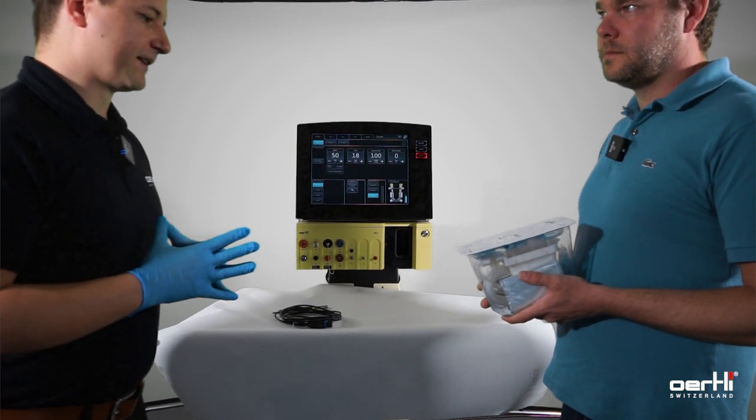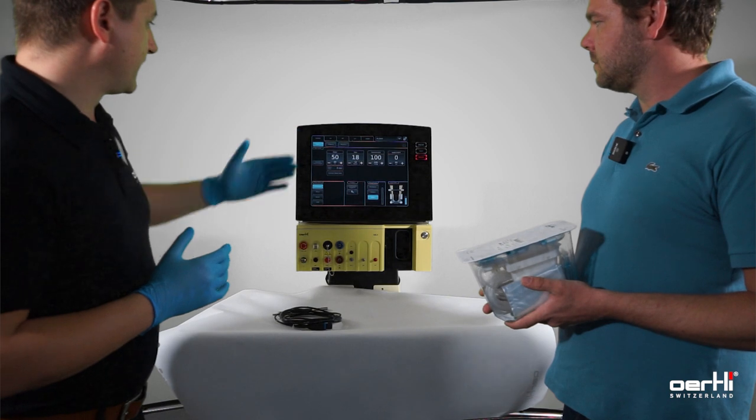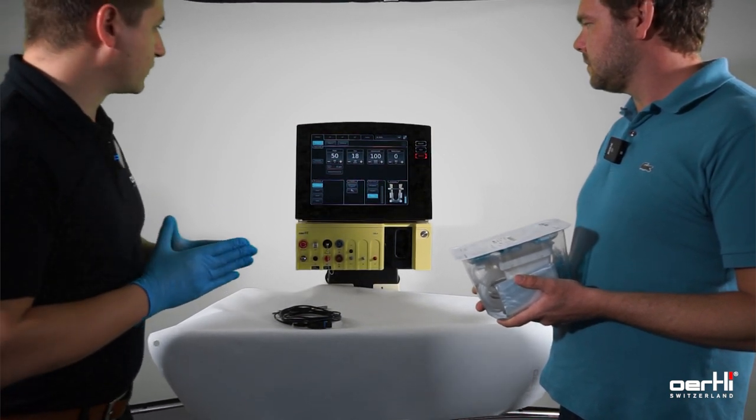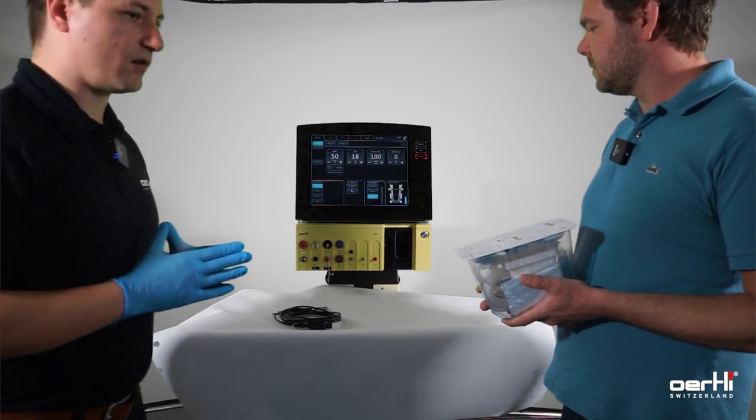Let's prepare a cataract surgery. First, ensure that the phaco function is already open. You have selected the right surgeon, your handpiece and sterile instruments are available.